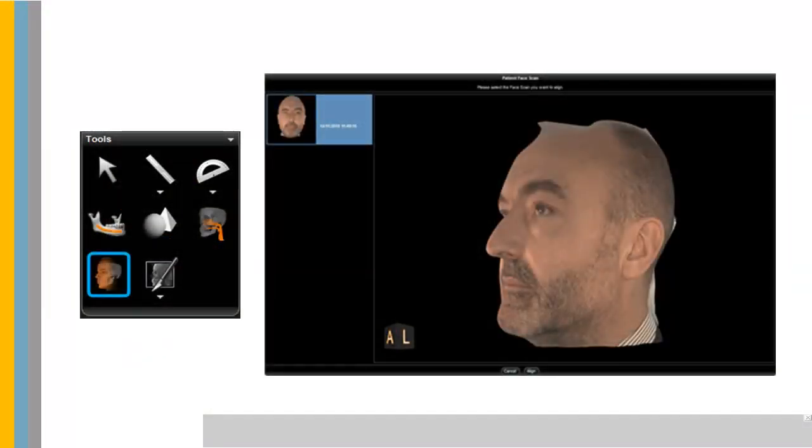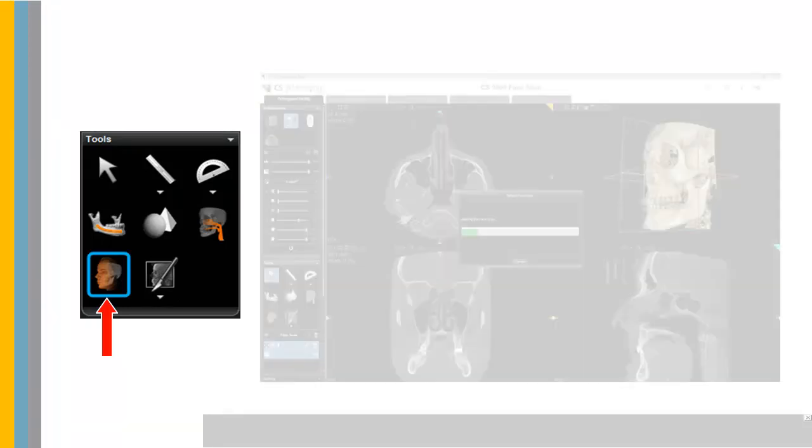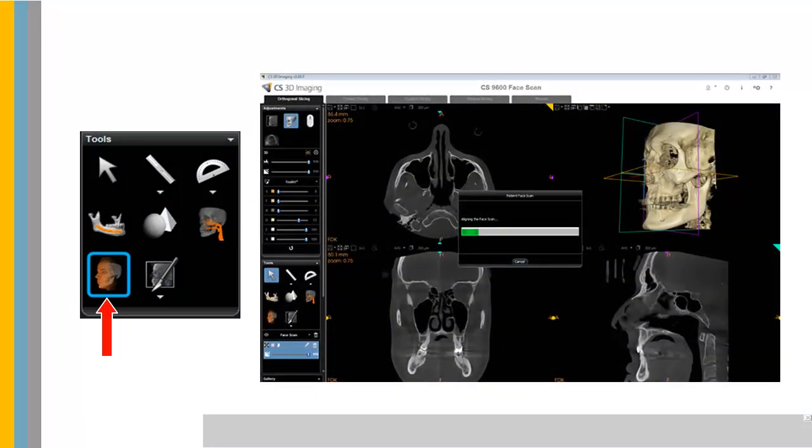To register the face scan with the 3D volume, select the Face Scan button in the toolbar. Select the Face Scan to register and click Align.